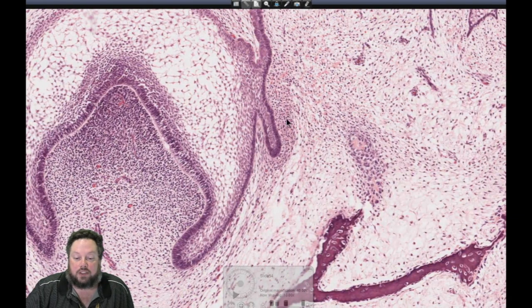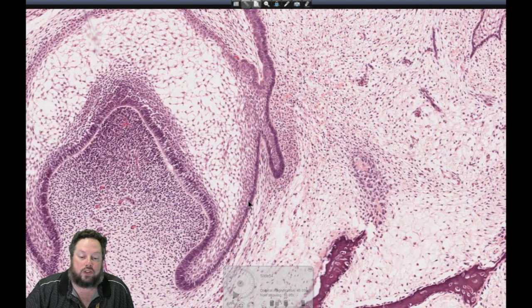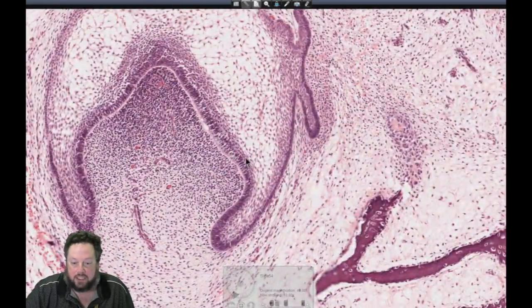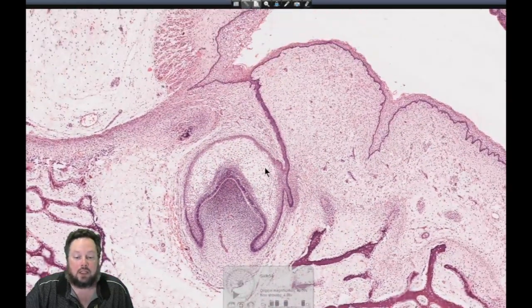So this is, as I say, the permanent tooth bud. This is going to develop a new tooth over time that will eventually push this deciduous tooth out onto the surface, and eventually it's erupted and then shed there. Great. I'm glad that makes sense, Luke. Thanks for asking the question.